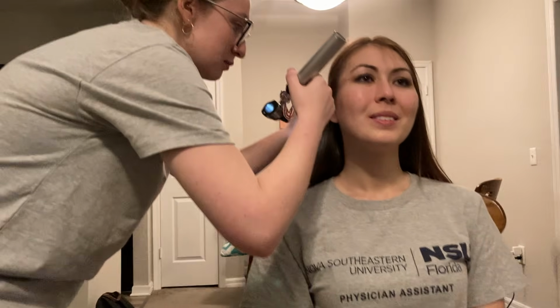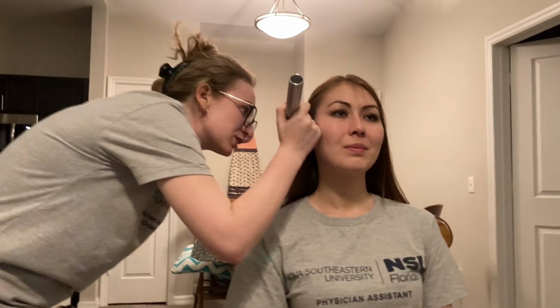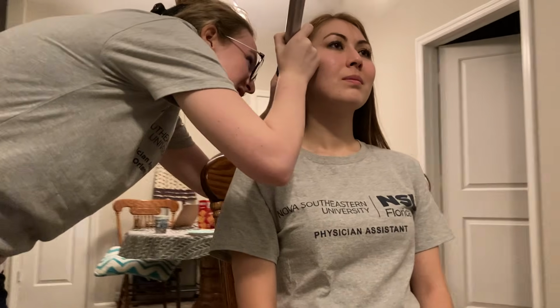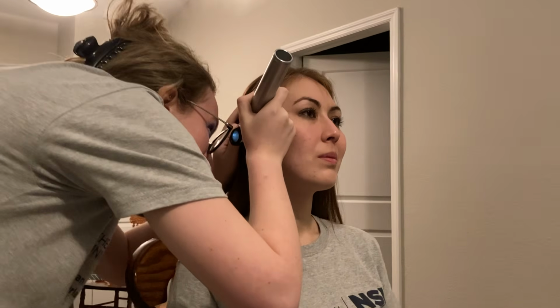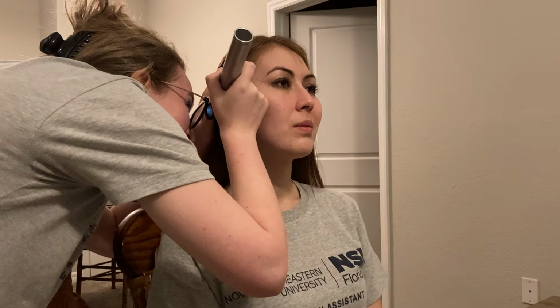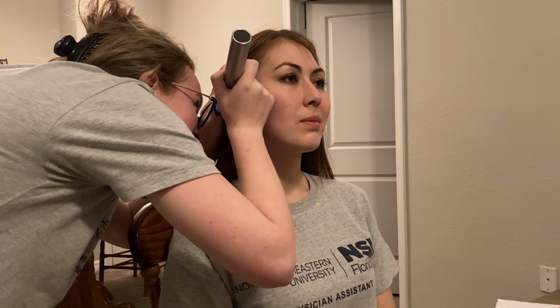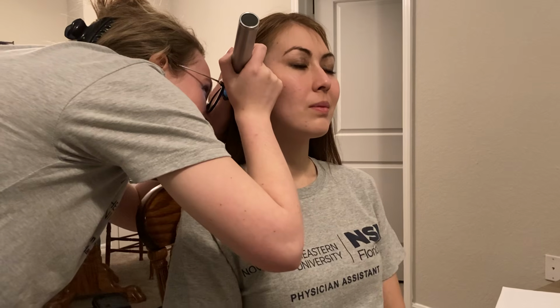Okay. So I'm going to start with your right ear. I'm just going to brace with my hands here, so that way if you move, I move with you. Okay, and I see that our external canal is clear. And I see our tympanic membrane is very pearly gray and translucent. I see that light reflex, and I see that it is antero-inferior.